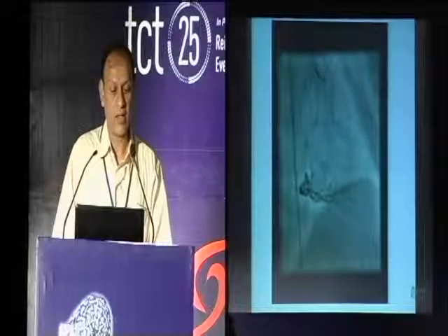This is the last example I'm showing you. This is a patient we thought at evening 5 o'clock we have taken up the patient, 2 stents, spot stenting in the mid RCA, and we thought, look at this angle there. It's not a very good angle between the guide catheter and the vessel there. And we thought probably we are doing well with this procedure.